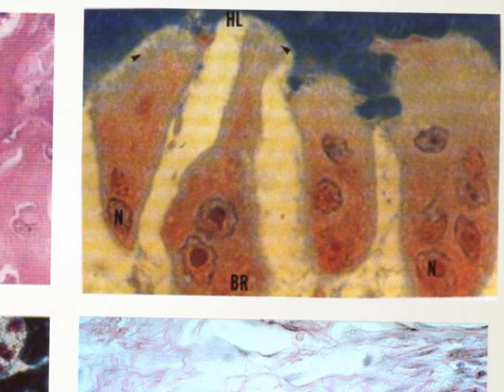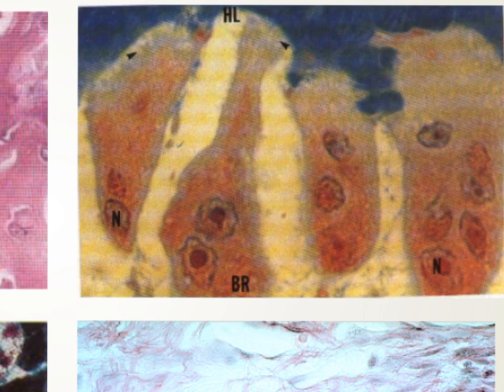Now, what we have in this picture? Actually, these are the osteoclasts. The osteoclasts are multinucleated. These are the nuclei present in the osteoclast. We have here 4 osteoclasts. Then we have this area which is called the brush border, like a brush, and it is towards the surface of the bone. This is the bone, and this is towards the surface of the bone.